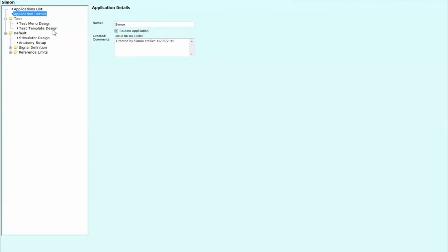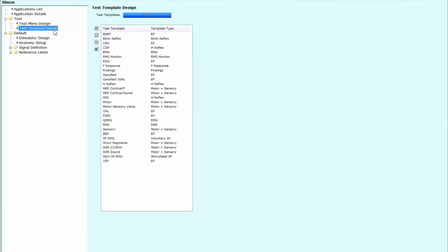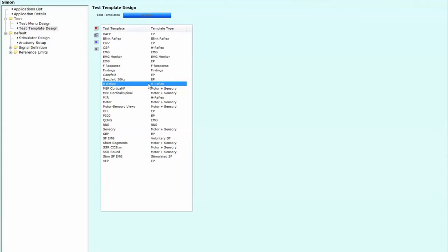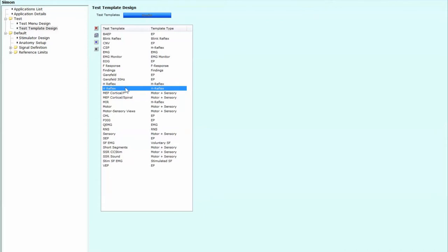And in our applications list, we have to go to our program. Now, this starts off actually with our template design. You can see a list down here of test templates. And what you're going to do is you're going to start with the H-reflex one. You can see how I've already labeled up CSP for the cutaneous silent period here. So let's start with the H-reflex over here. And what we're going to do is we're going to duplicate it.